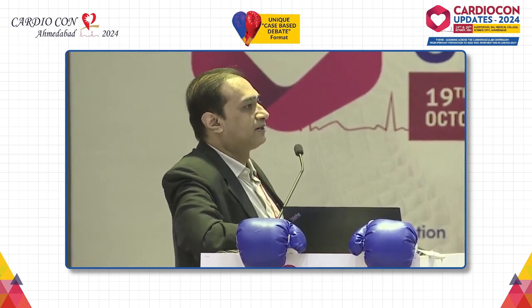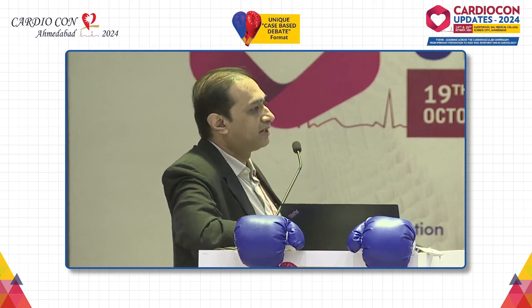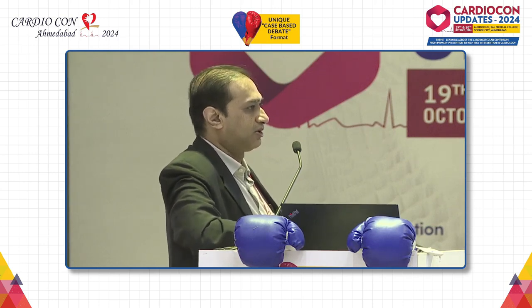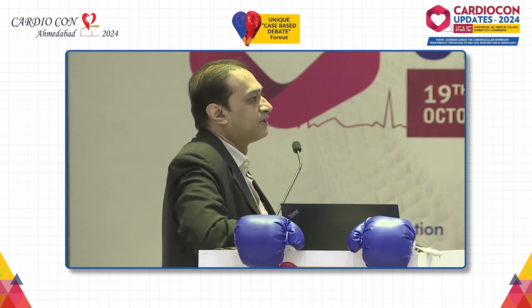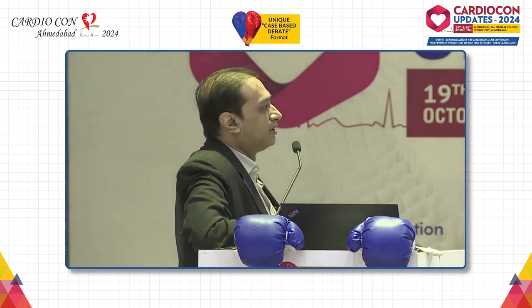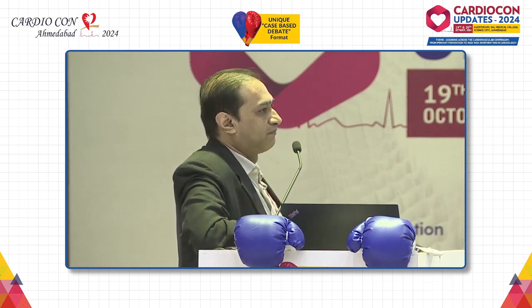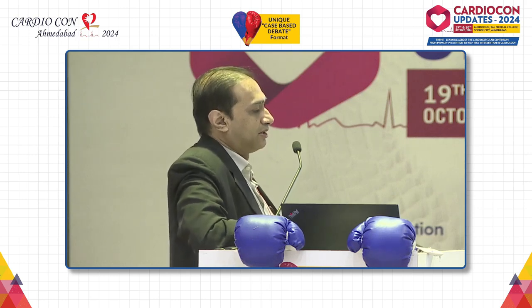Again, scar burden quantification is still not a substantiated indication for ICDs, because ICDs are only in post-ACS scenarios where you have acute MI and you want to prevent sudden cardiac death. But in a chronic scenario, how much the scar burden would be contributory or responsible for guiding you to put in an ICD if the EF is not as bad as the cutoff of 35 or 30%, beyond 40 days or 28 days, depending on the scenario.